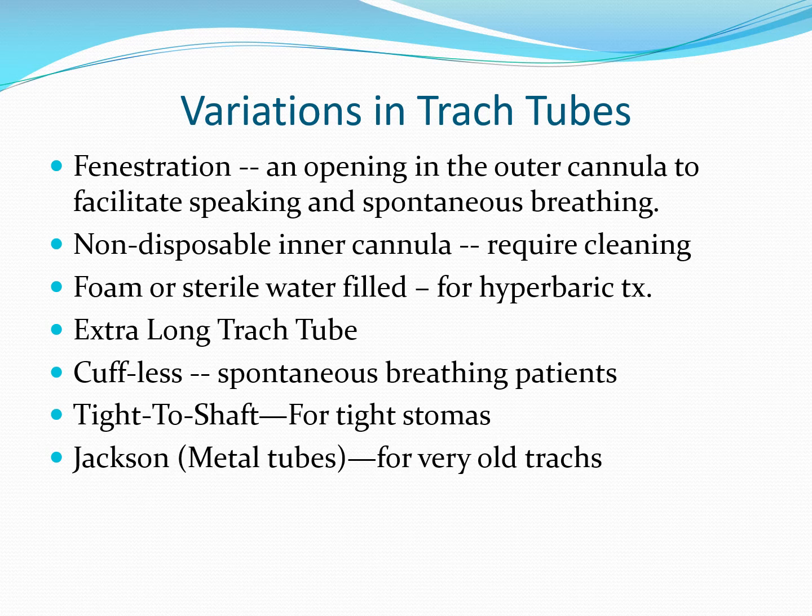And then you have the old Jackson metal tubes. The Jackson metal tubes were at one time made of silver. For a whole lot of reasons, scarcity of silver, the cost of silver, things along those lines, they switched over to stainless steel, surgical grade stainless steel. But just bear in mind that folks that had Jackson tubes that were silver, silver is bacteriostatic. So that silver wasn't used for bragging rights or anything along those lines. It was used for a very practical reason, that silver will tend to discourage microbial growth. You won't see many of those, but they're out there.